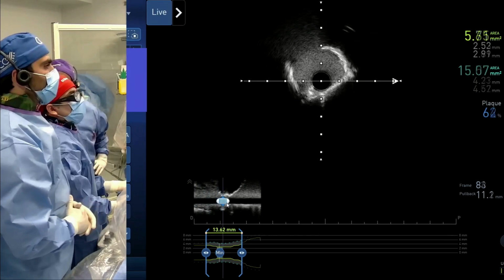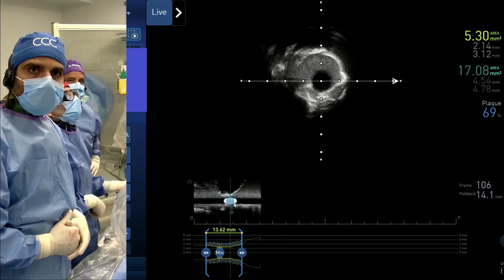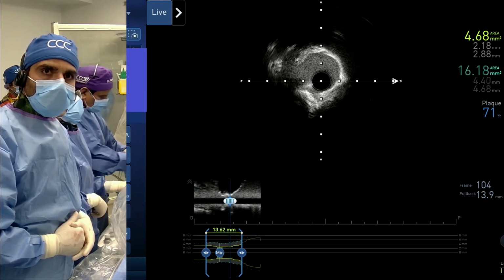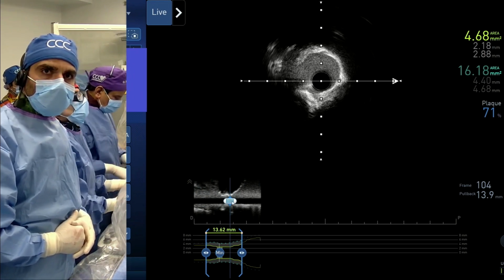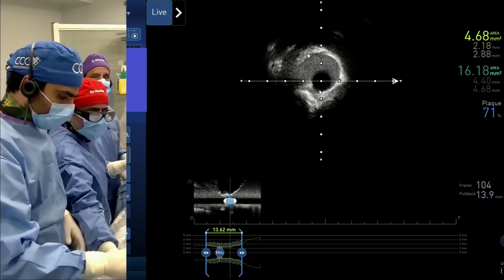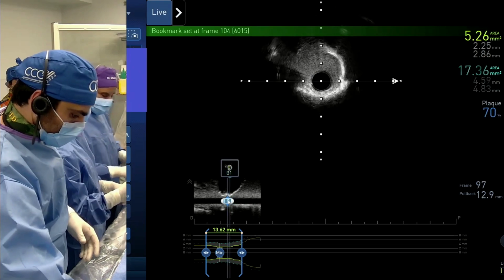So now tell us, what do you see? Sure. So this is a distal left main. At least the area is much better. But did you do any cuts of the calcium? I think so. This is kind of some fractures, a little bit of cut by the IVUS. We saw the cuts here, fractures. You've got fractures in 2 spots and maybe 3 spots actually.